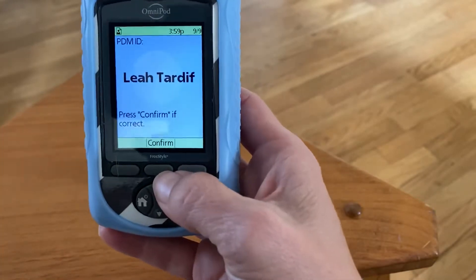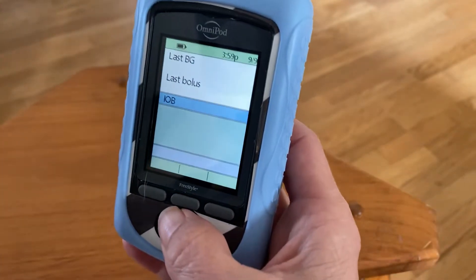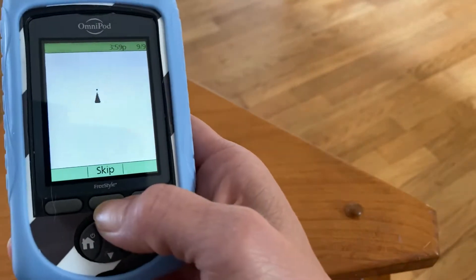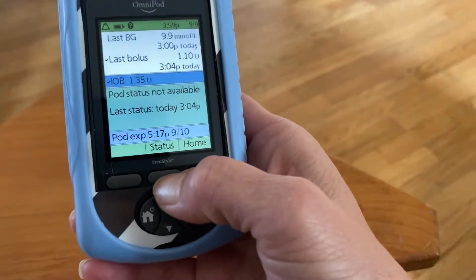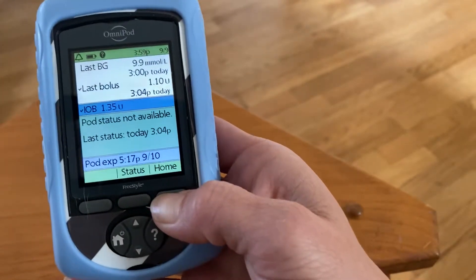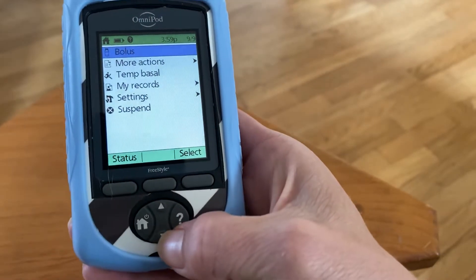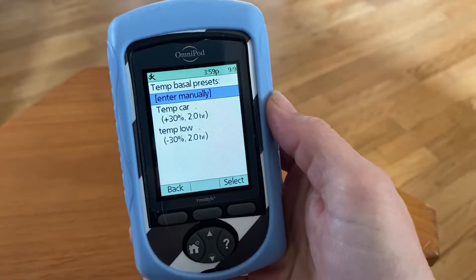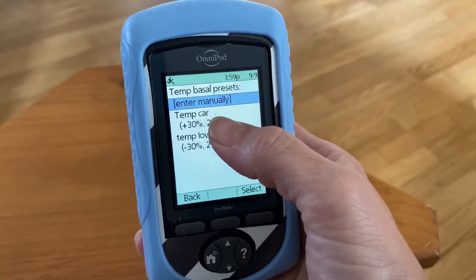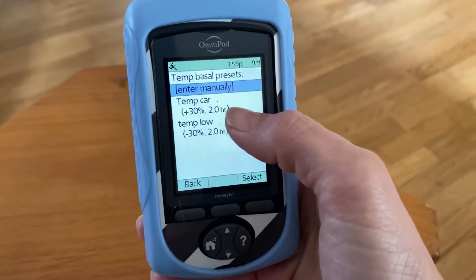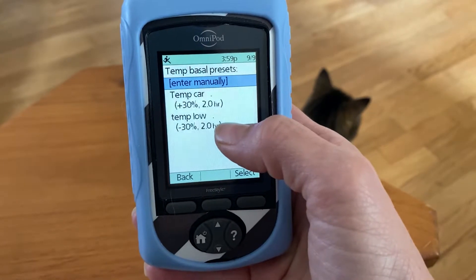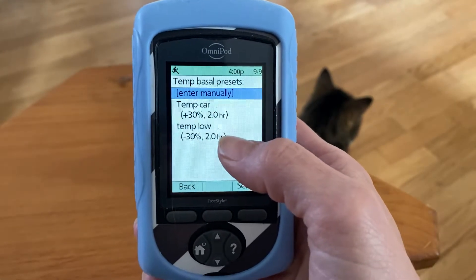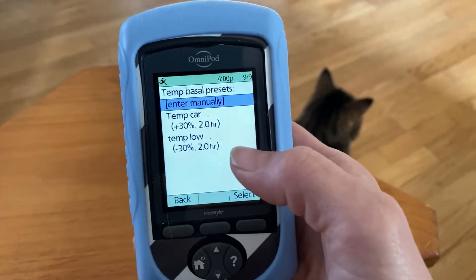To do that, you just turn it on and confirm she is the correct person. You go to home and scroll down to where it says temp basal. We have a couple of preset ones in there already — I have a preset for an increase that's plus 30 percent, and a preset for a temp basal decrease at minus 30 percent.